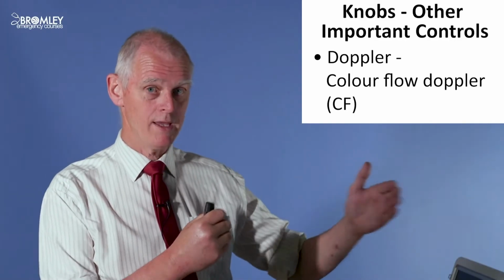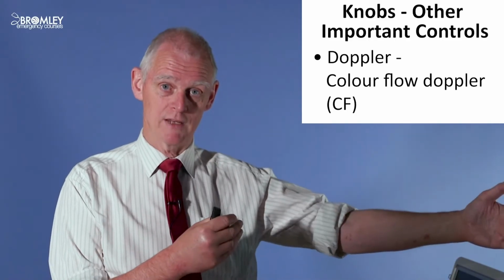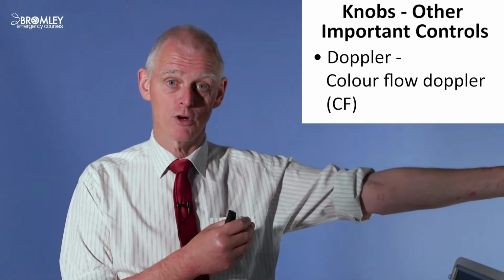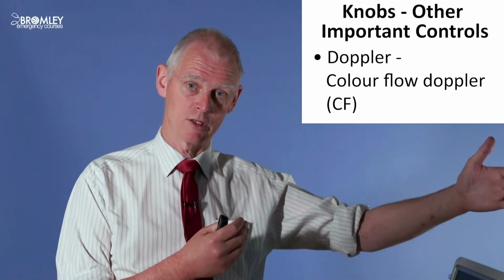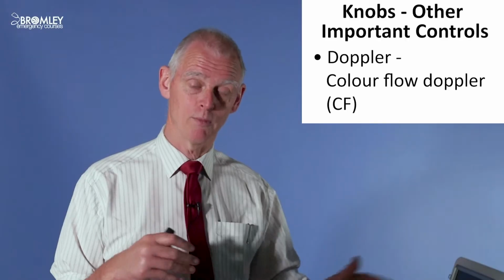As it moves away, the wavelength is stretched by the same thing. As the wave finishes leaving, the engines move further away, and the wavelength is longer, the frequency is lower. So that's the Doppler phenomenon, the Doppler shift. We see this a lot in physics, in the natural world. For example, in light, we talk about stars having redshift, because the faster they're moving away from us, the more the light is changed, the frequency is changed.